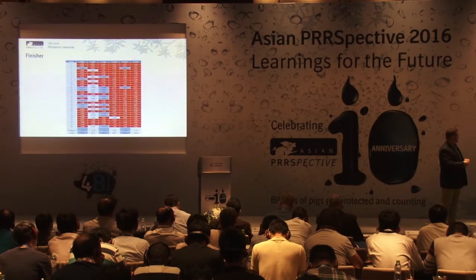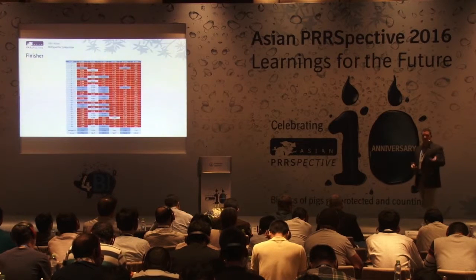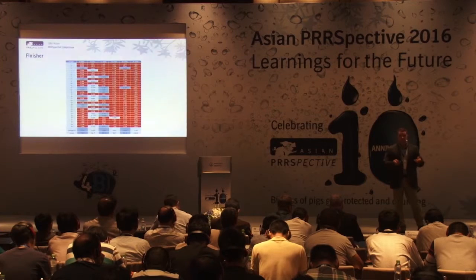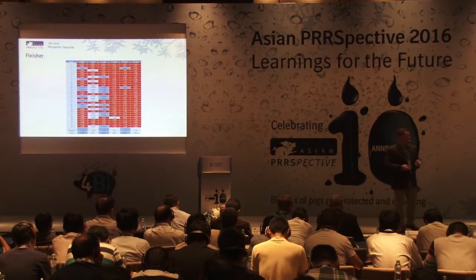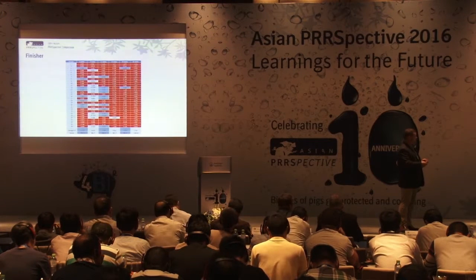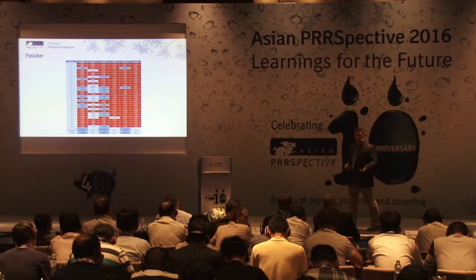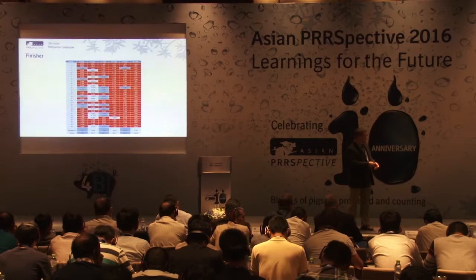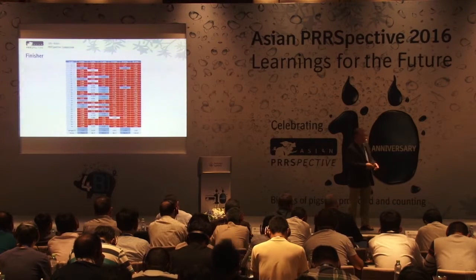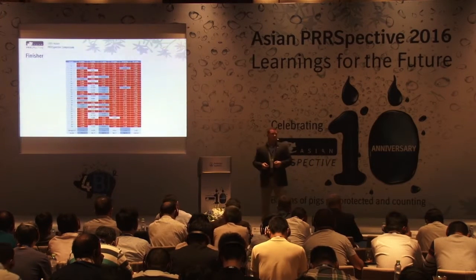Something funny starts to happen though. At 11 weeks of age, our average S to P ratio rises, and the percentage of pigs that are ELISA positive rises. This is going in the opposite direction of what we want or what we would expect, such that at 19 weeks, almost all the pigs are ELISA positive, and at 24 weeks, every pig that we test is now ELISA positive. We had a very nice trend early on where our ELISA was decreasing, but all of a sudden we've gone from less than 50% to 100% ELISA positive. So what can we make of this situation?